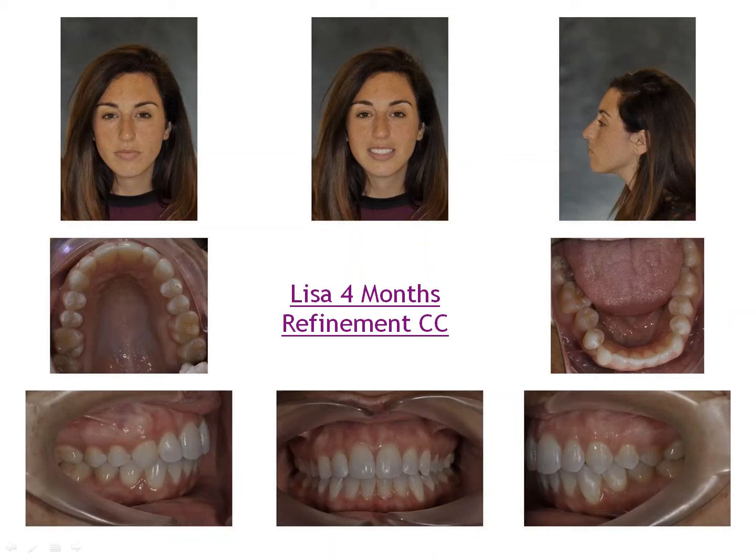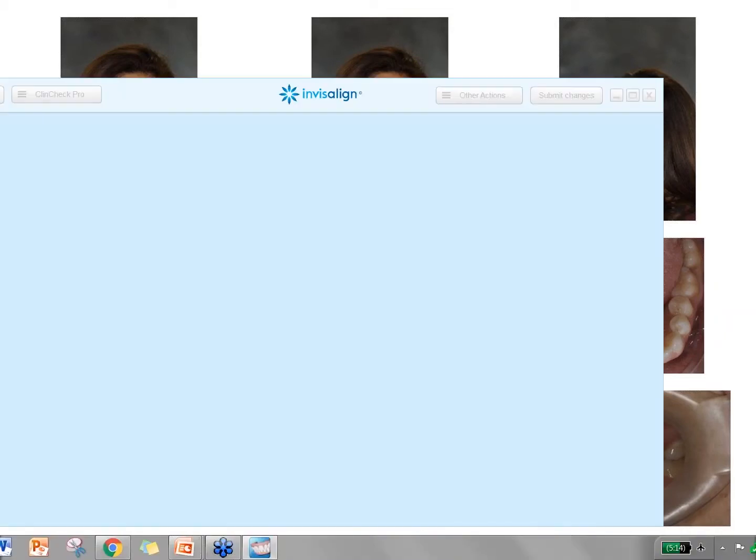We're going to be doing some arch expansion here to be able to get her bite in just the right place for her. Here she is at the end after 4 months with the little Propel, and this is her refinement now. I'm going to tweak things in. I want to get her bite just right. I'll show the refinement Clincheck real quick.